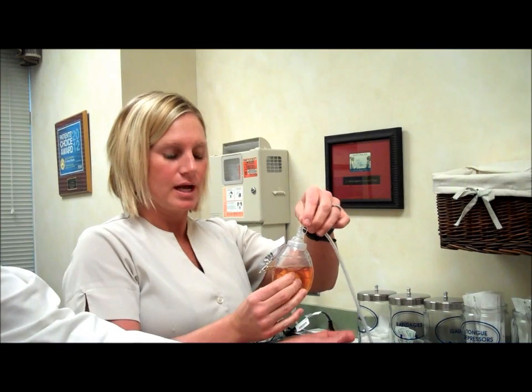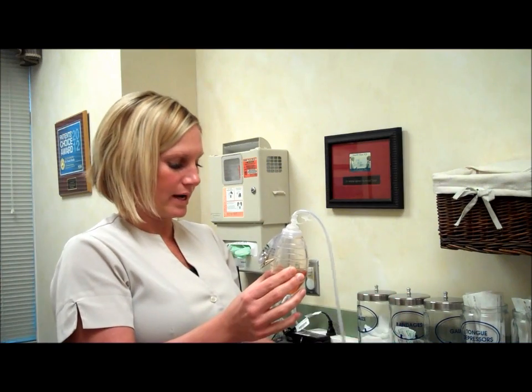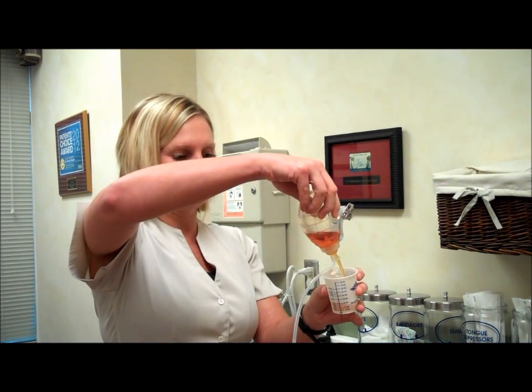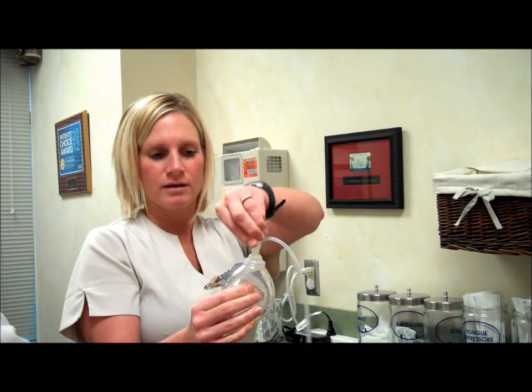Okay, we have put some colored fluid just to demonstrate exactly how to empty the bulb. When this is always working appropriately, it will always have a suction to it when it's inside the body. Basically what you're going to want to do is release the top, and I always give patients these little Dixie cups. It's got the measurements on there. Turn this upside down, empty the fluid, keep track of how much is coming out of the drain, and then you always want to compress and hold as you are closing that back up.